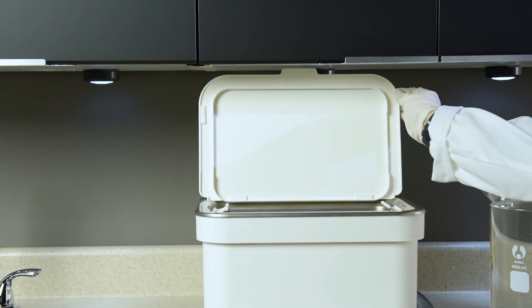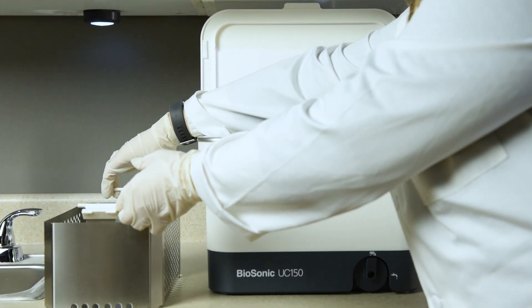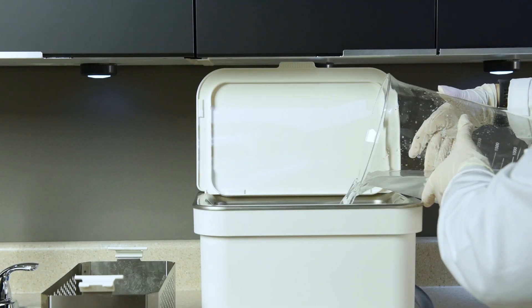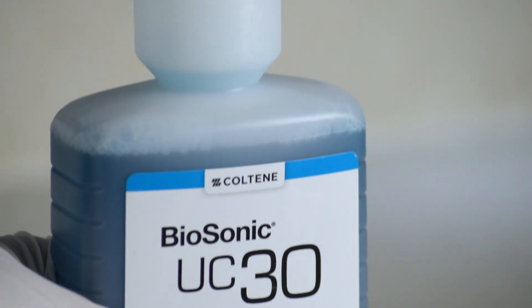Degassing is necessary each time a new solution is added to the tank. Your Biosonic unit is equipped with a degas cycle that prepares your solution for use. To begin the degassing process, add water and ultrasonic cleaning solution into the tank.